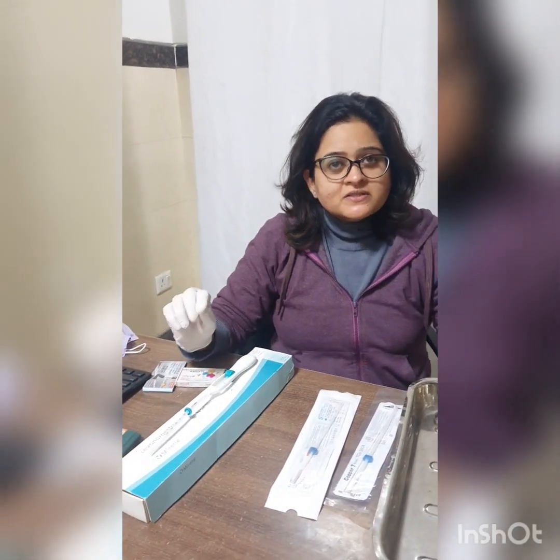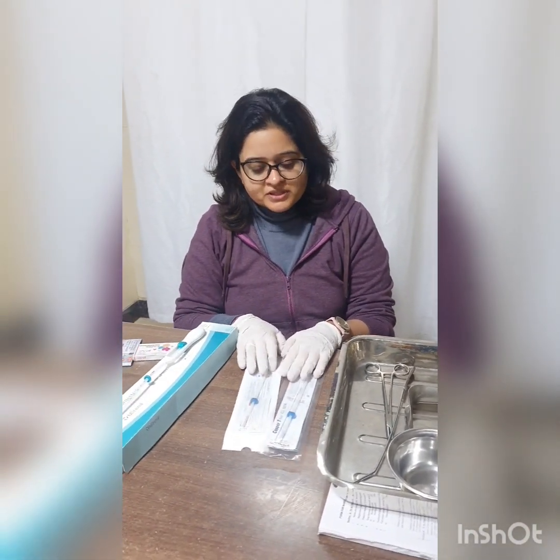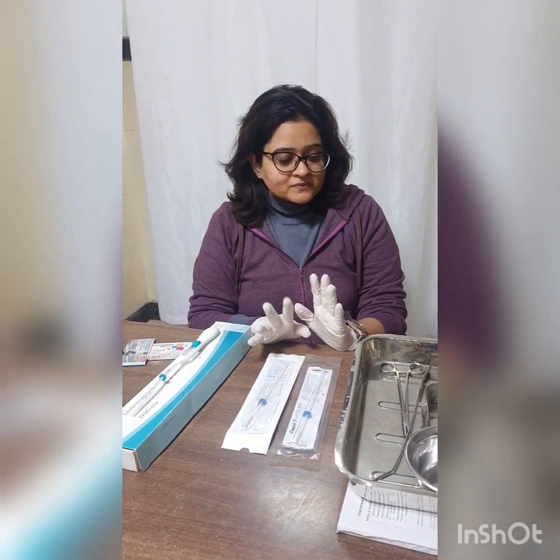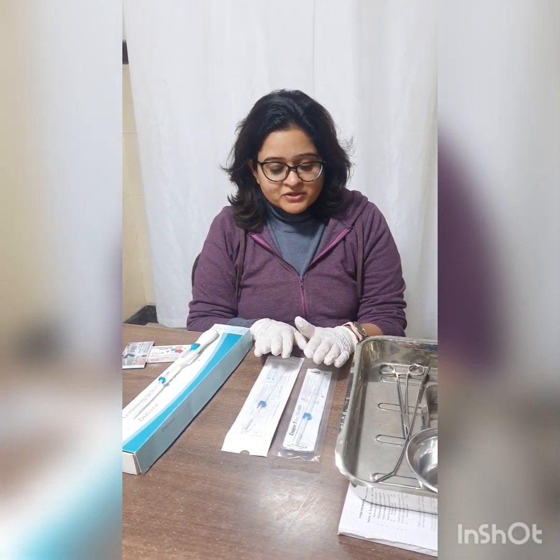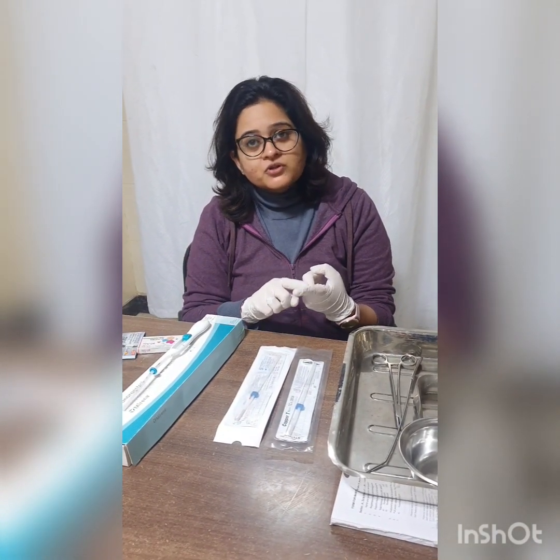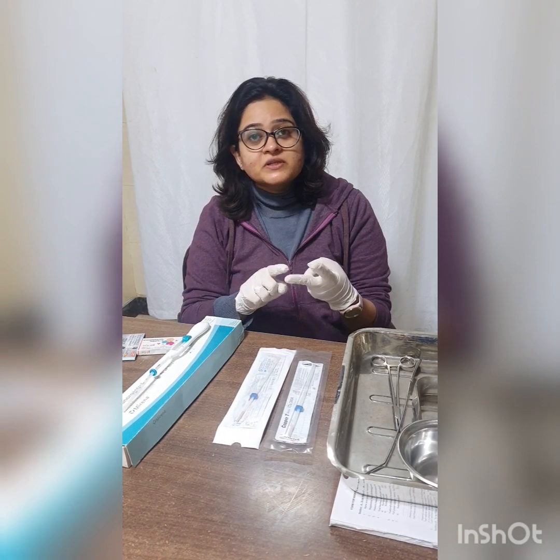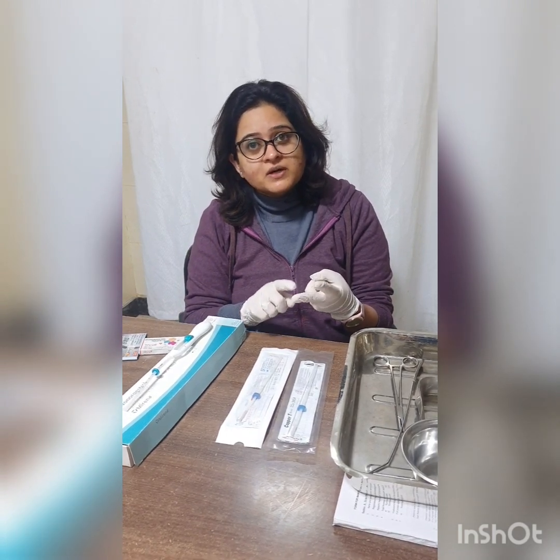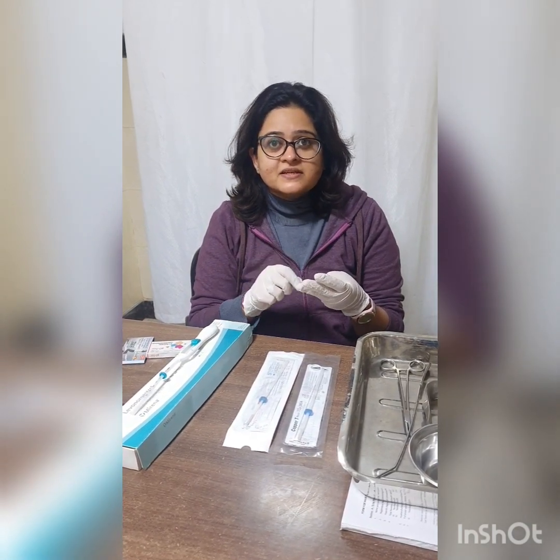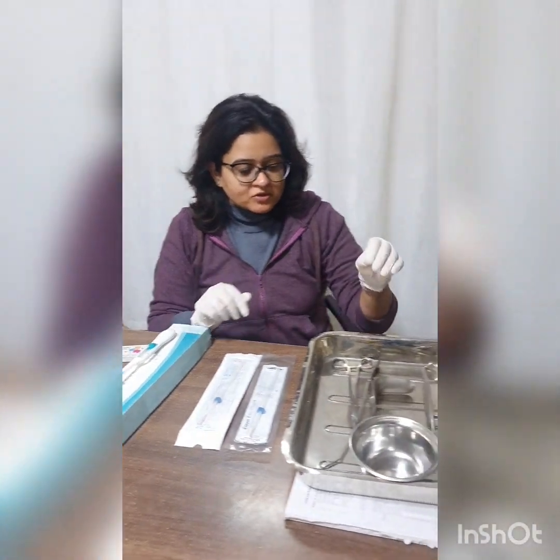I will be showing you the insertion of a Copper T-380A. Insertion is usually done either post-menstrually or following an abortion — post-abortally. It can also be done following delivery, that is post-partum copper T insertion. It can also be inserted concomitantly at the time of a cesarean section.